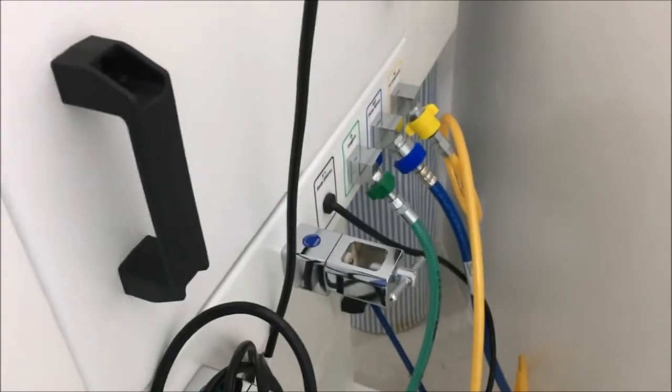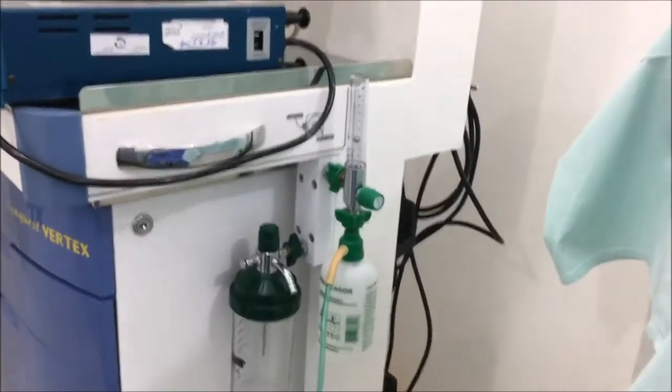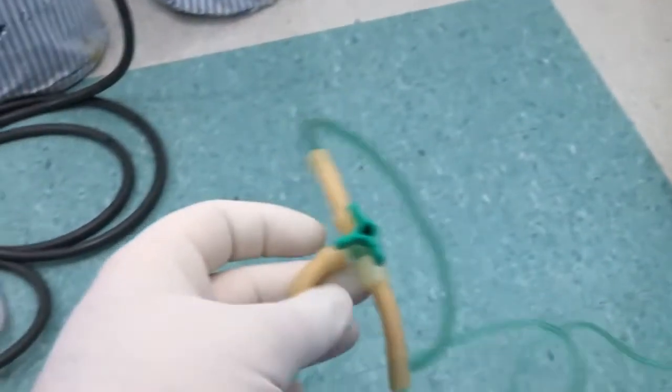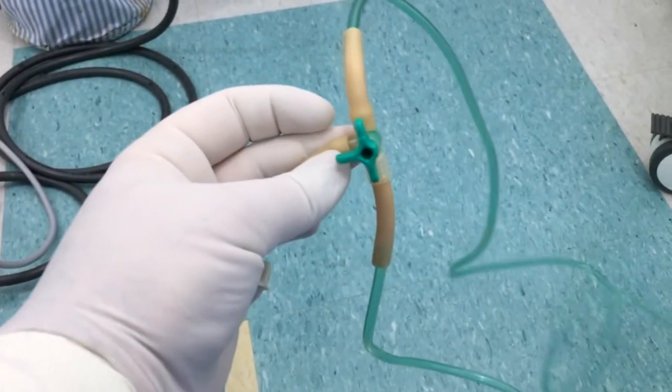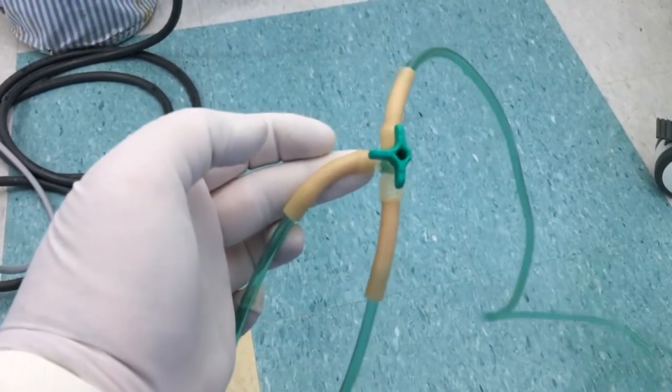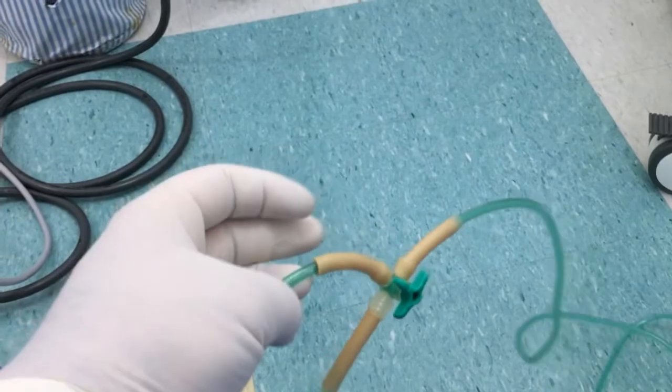And there is no better option if your vitrectomy machine is not working than the anesthesia cart. Here you can see that we have the oxygen tubing installed with a three-way stopcock in order to leave the original tubing to avoid hypoxia and add a second one which will substitute the compromised air pump.